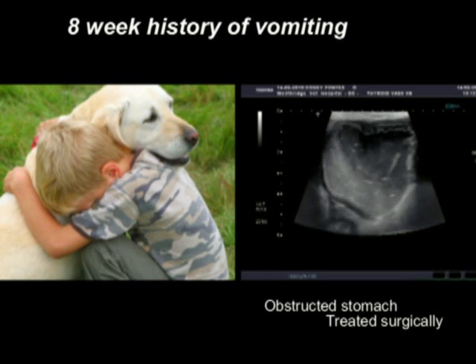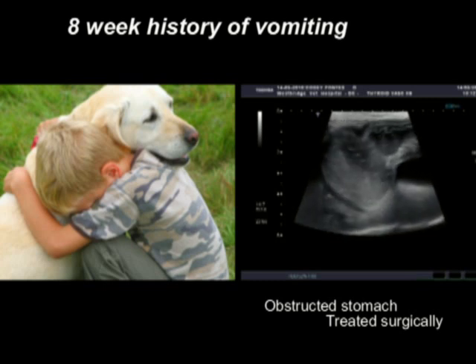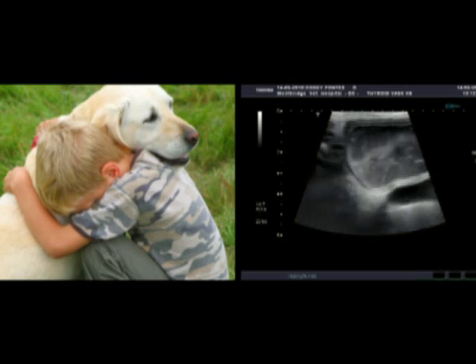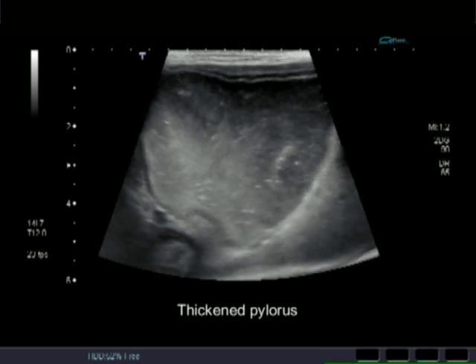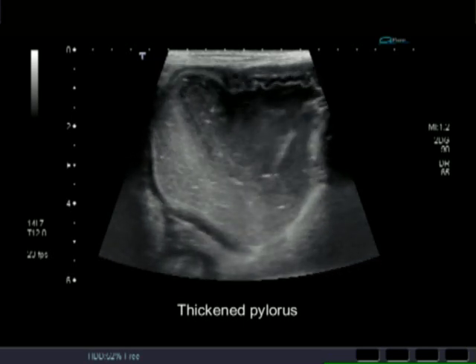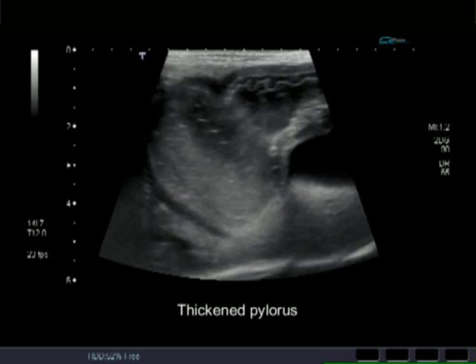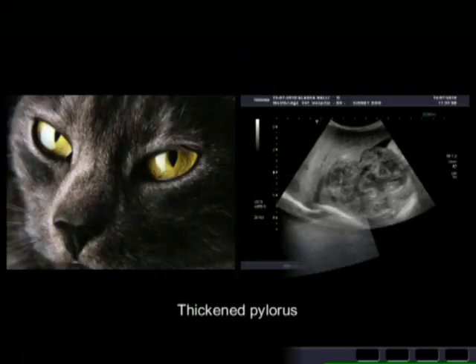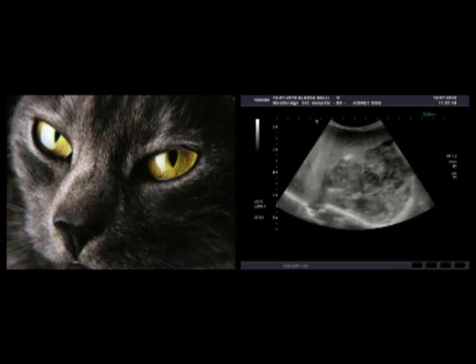This dog had an eight-week history of vomiting and his stomach just didn't seem to be able to empty. Closer observation on the video showed a thickening at the pylorus, which is a valve that empties the stomach. Surgical correction resolved this very effectively for this patient.